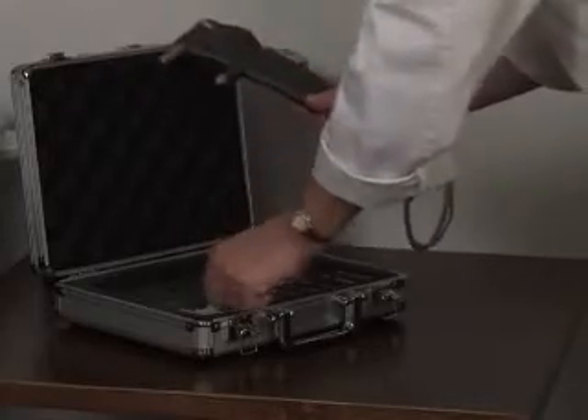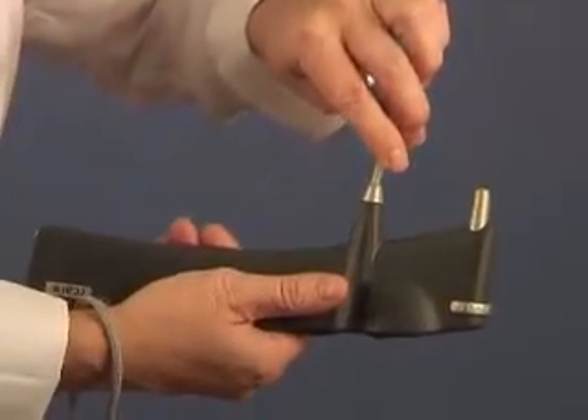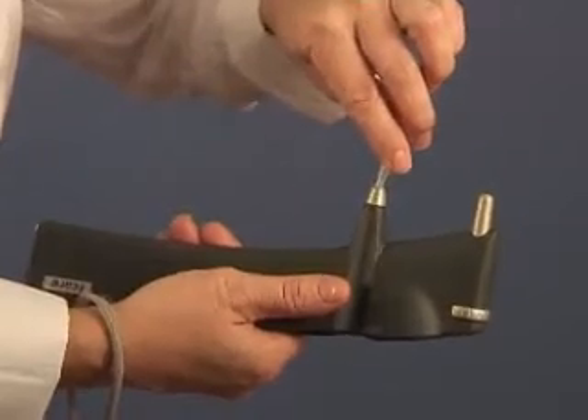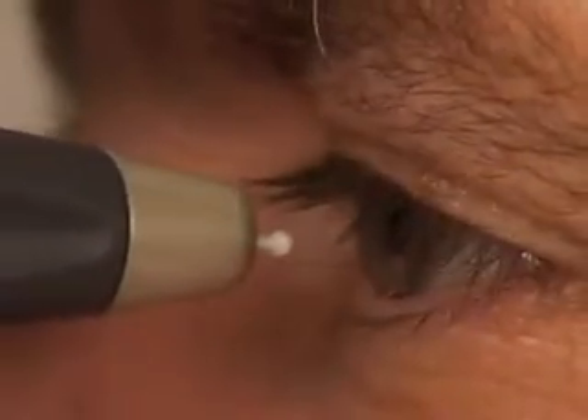The single-use disposable probe guarantees microbiological safety. Based on a new measuring principle, in which a very light probe is used to make momentary contact with the cornea, the process does not cause any noticeable discomfort for the patient. Thanks to this unique method, no anesthetic is needed, and the rapid measurement is barely noticed by the patient.